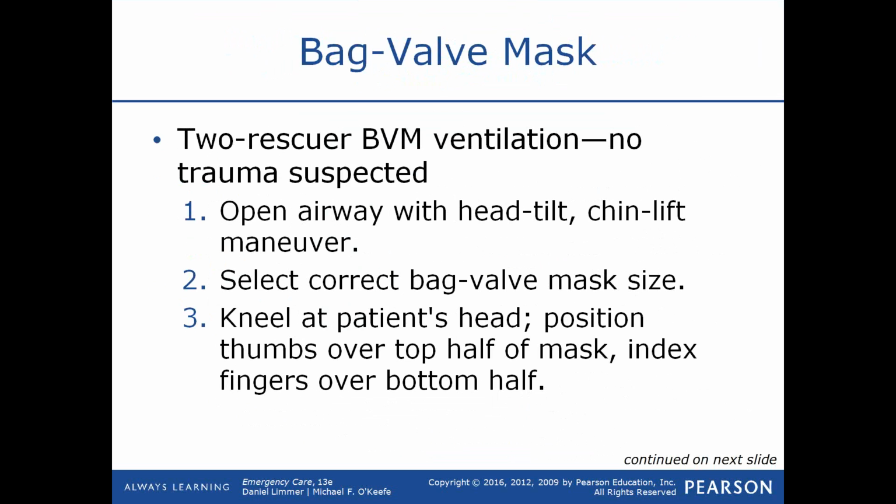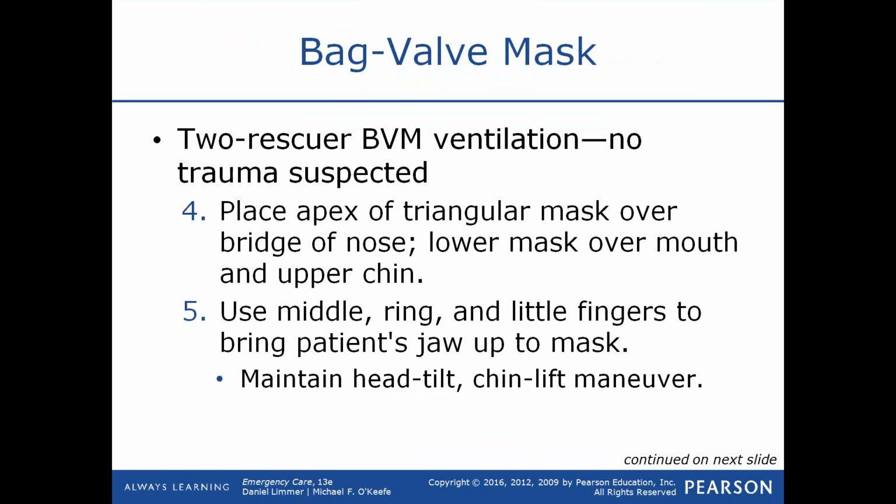So what you want to make sure you don't do is just randomly, on every patient that you try to ventilate, squeeze the entire contents out of the bag into the patient, because that'll overinflate their lungs and it will increase gastric distension. And here they're just talking about the picture that they showed earlier of the fingers on the patient's jaw and around the mask.